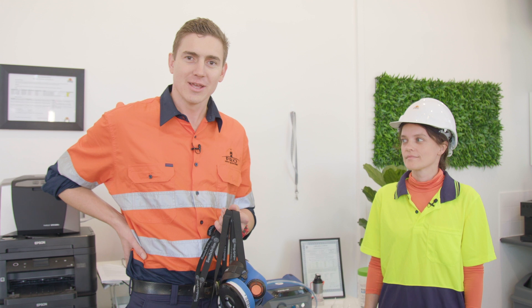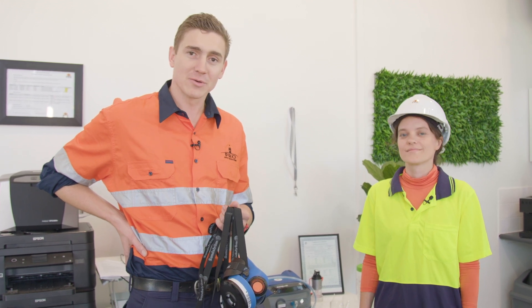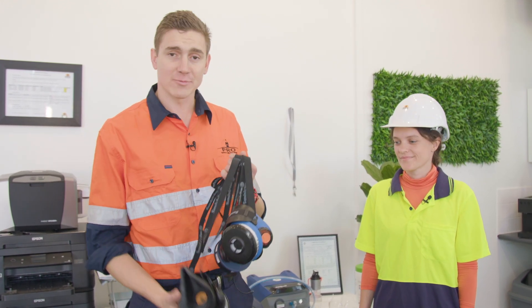Hey guys, Seb from Pro Safety and Training. Today we're here with Yulia and we're going to be doing some face fit testing on a couple of different respirators.